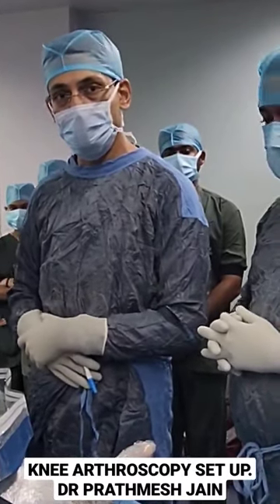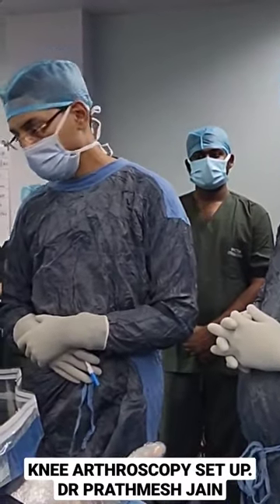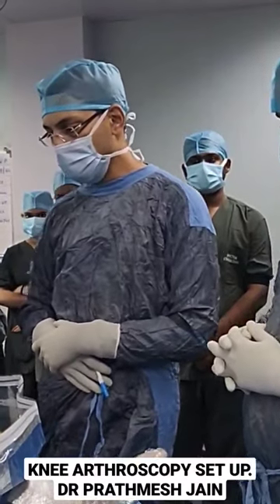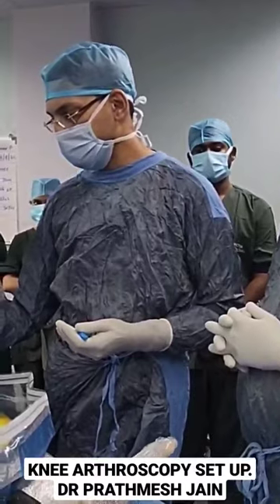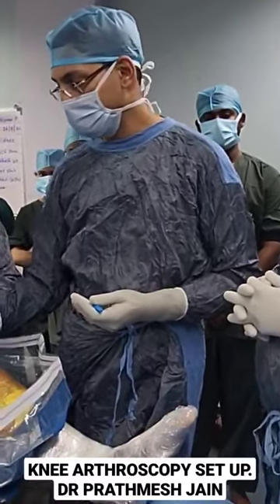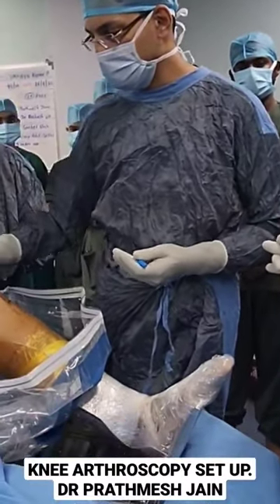Demonstrating our knee arthroscopy setup and portal positioning. We do knee arthroscopy in a supine position. We usually put a side support at the level of the thigh, and the tourniquet is almost at the level of the side support.